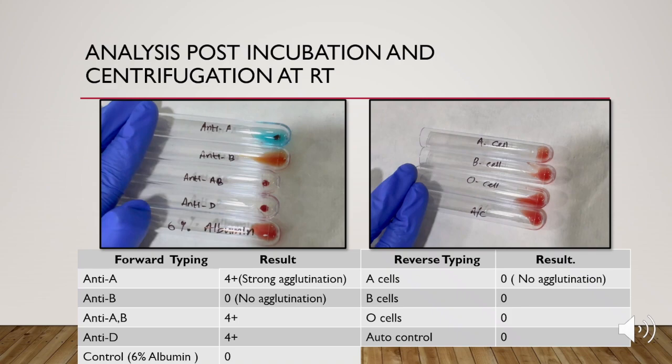This is the side-by-side analysis of the results that we have obtained after incubation and centrifugation at room temperature. In forward grouping, we can clearly see a strong 4 plus agglutination reaction in anti-A, anti-AB and anti-D, suggesting A positive blood group. Whereas in reverse grouping, there is no reaction in all the 4 tubes. Hence, we cannot confirm the blood group as A positive from reverse grouping. This might be possibly due to a weak or a missing antibody.